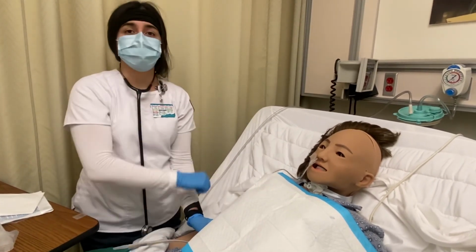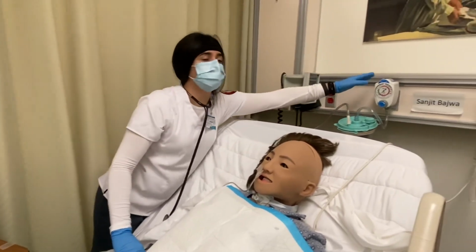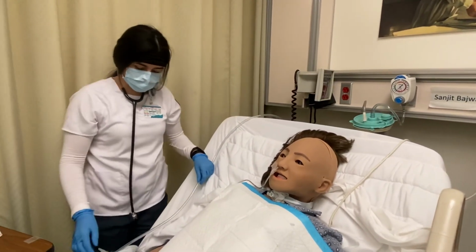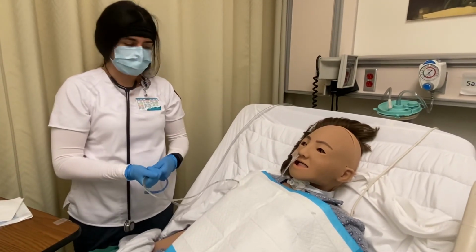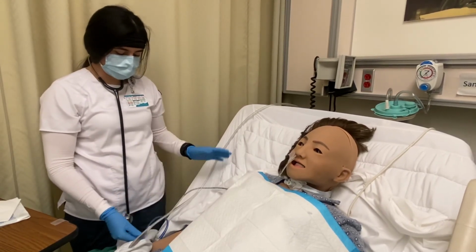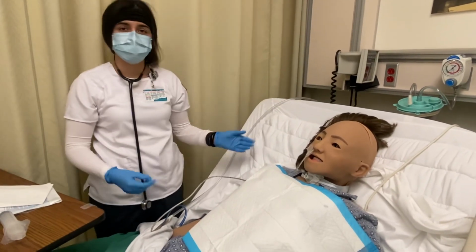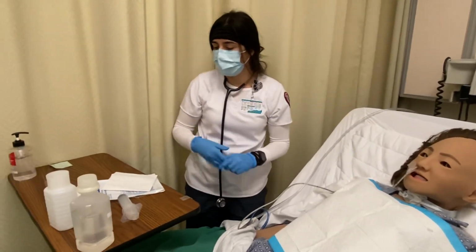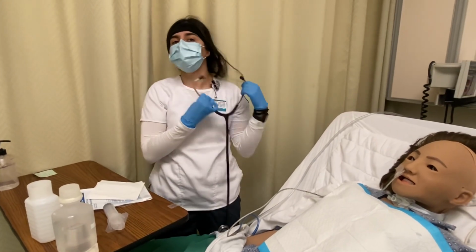I put the call light here, and then I would also put the suctioning to low intermittent and connect it here. Low intermittent, and call light, put the rails up, and then hand hygiene, and then clean up, and then walk out of the patient room, and then I'm done.